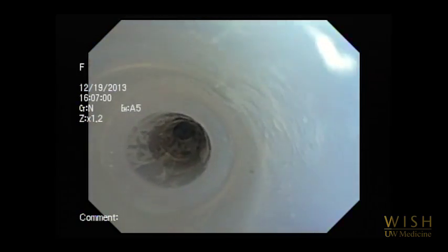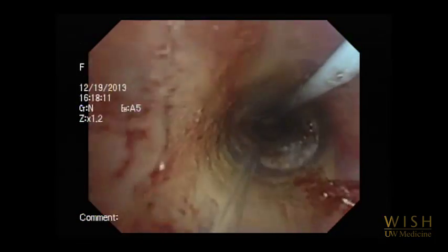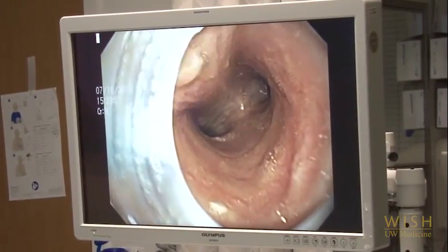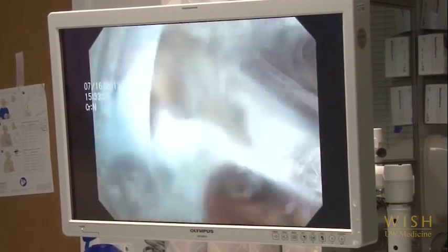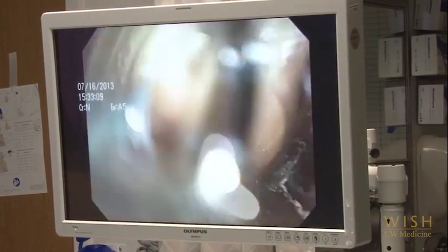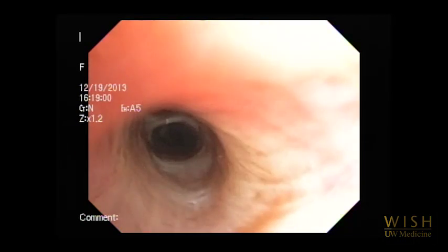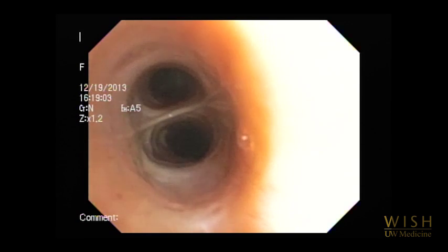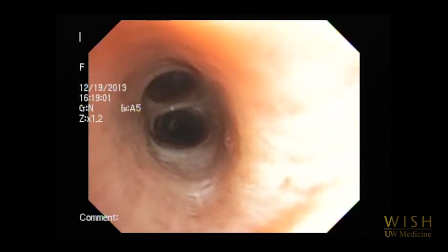Once inserted, the bronchoscope is guided as far as possible into the peripheral airway of the target location, avoiding use of suction if possible. Additional 1 to 2 milliliters of 2% lidocaine can be administered directed at the carina and other bronchial bifurcations to decrease airway irritation. Once wedged in the peripheral airway, apply brief, gentle suction to determine if the airway collapses. If collapse lingers after the suction button is released, the scope may be wedged too deeply and should be retracted slightly. Use low-pressure wall suction to avoid complete, prolonged airway collapse, which would decrease the yield of lavage fluid collected.